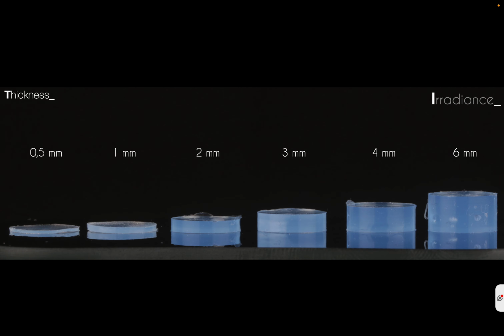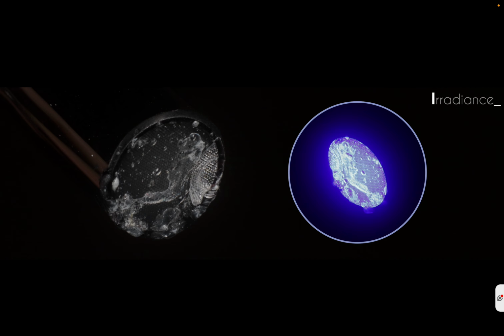Another important thing is that the thickness is super important. So if you have a small thickness, you can deform the silicon. The light passes excellently, but the silicon is completely deformed. The important thing is to choose an appropriate material that allows the light to go through, but maintains the consistency and the modulus of elasticity of the silicon.